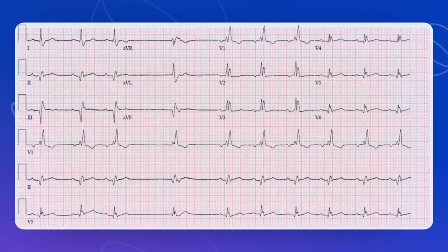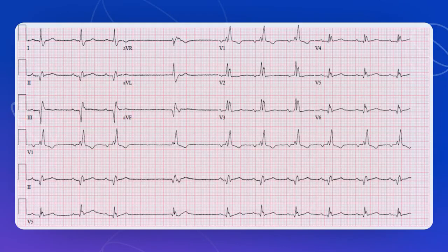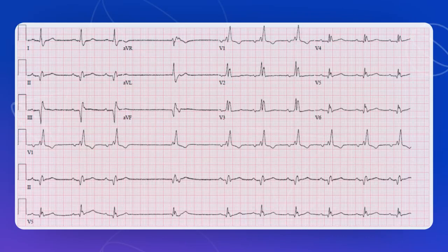On the second ECG: right bundle branch block — QRS complex more than 120 milliseconds, more than three small squares. Look at the RSR pattern in V1, that confirms right bundle branch block. Next, check the axis: lead one is up — that's okay. Lead two is predominantly downwards — that's left axis deviation. So we've got right bundle branch block and left axis deviation: that's bifascicular block.